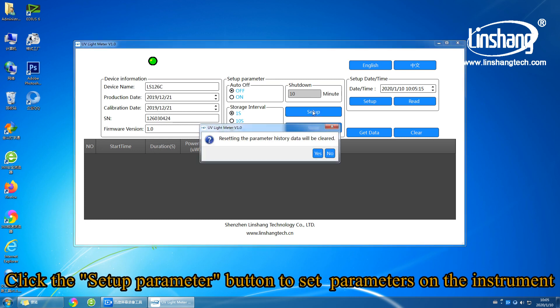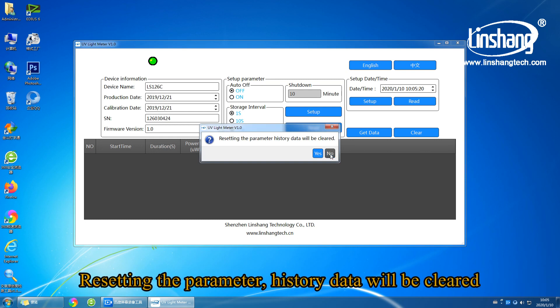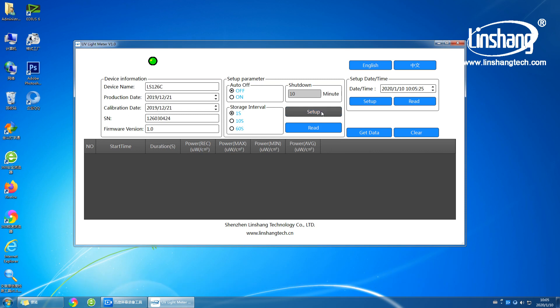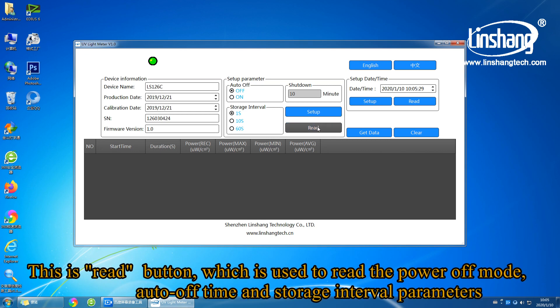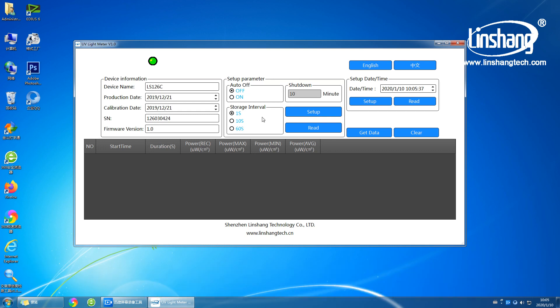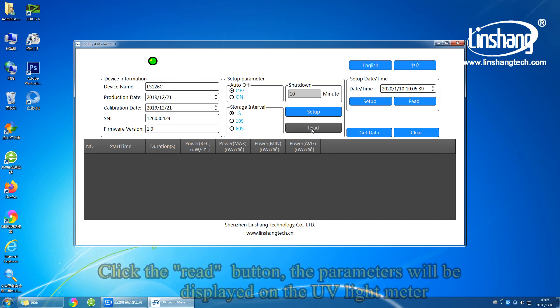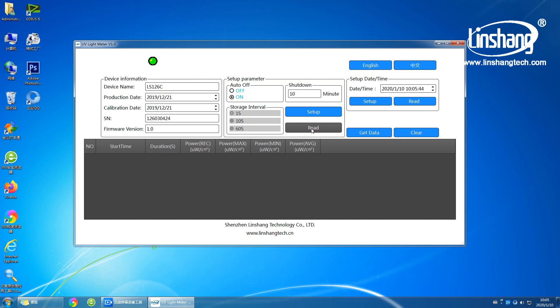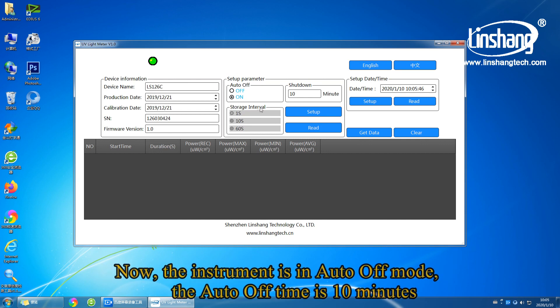Click the setup parameter button to set parameters on the instrument. Note that resetting the parameters will clear the history data. This is the Read button, which is used to read the power off mode, auto off time, and storage interval parameters. Click the Read button and the parameters will be displayed on the UV light meter. The instrument is currently in auto off mode with an auto off time of 10 minutes.